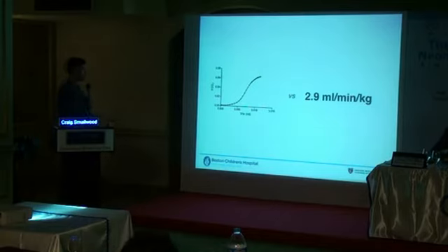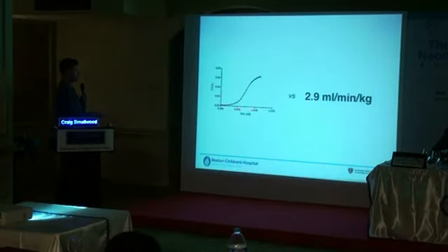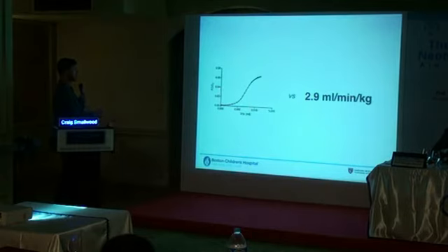This is actually data that I collected on a newborn with congenital diaphragmatic hernia. You can see here is the fraction of CO2, so basically like 2%, 4%, 6%. And you can see here is the total tidal volume. As the exhaled volume is coming out of the patient, we're simultaneously measuring the CO2. This is what the machine does. At each time point, it records what the CO2 is until we get to the end of the breath. So tidal volume is about 12 mLs. What the machine does automatically is calculate the area under that curve. You're just multiplying the volume times this fraction, and that gives you the CO2 elimination.